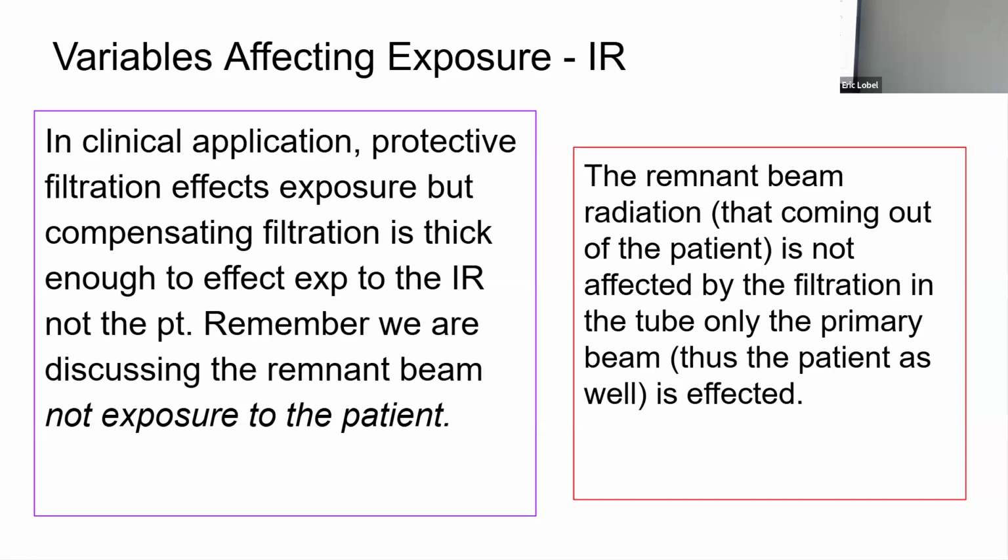Or we're getting rid of the low energy, also known as longer wavelengths versus shorter wavelengths. These are the photons that would just not contribute to subject contrast. As I like to describe it, these are the photons that hit a hair on your belly, you know, and then don't do anything for the contrast in the image, right? But they add to the dose to the patient. So filtration is a good thing.